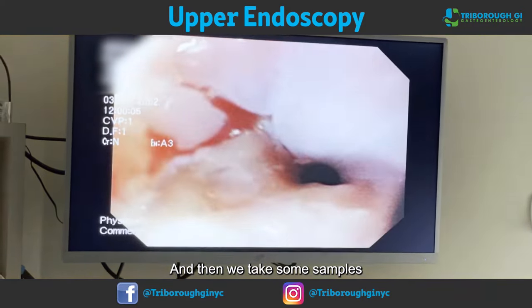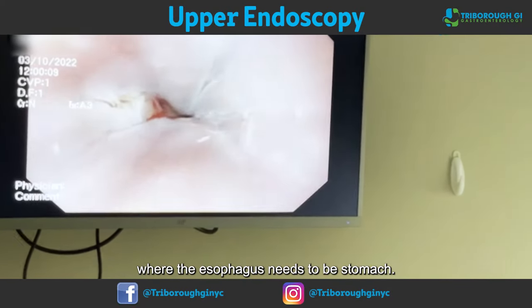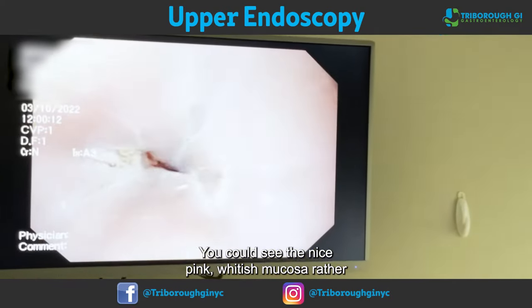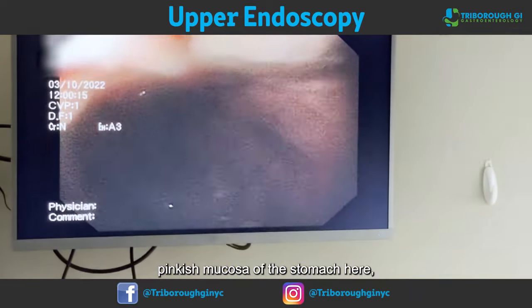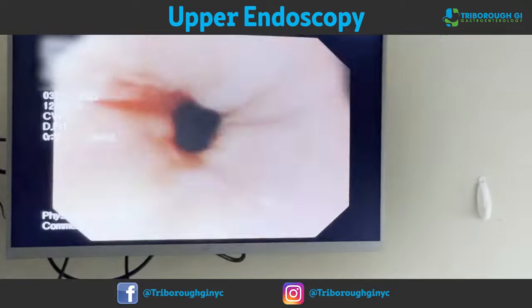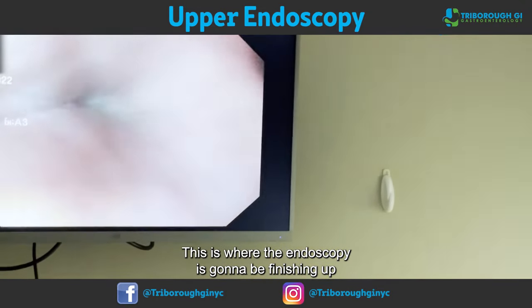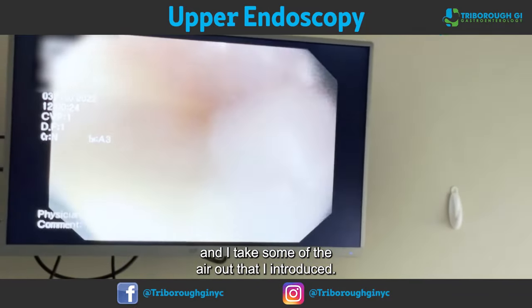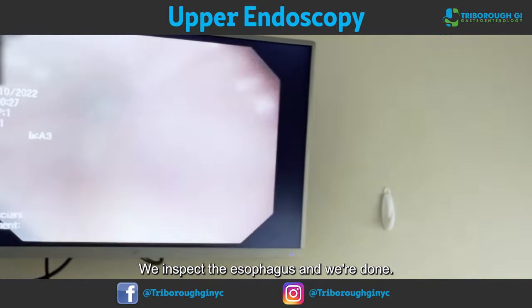We take some samples at the gastroesophageal junction where the esophagus meets the stomach. You can see the whitish mucosa of the esophagus turns into the pinkish mucosa of the stomach here. Everything looks great. This is where the endoscopy is finishing up — we draw the camera, take some of the air out that was introduced, inspect the esophagus, and we're done.